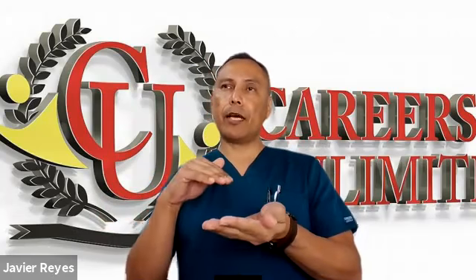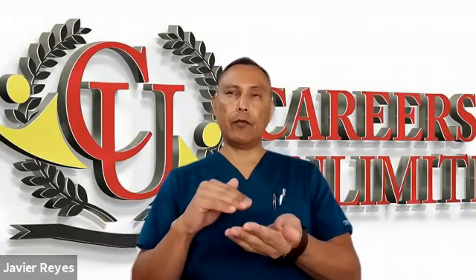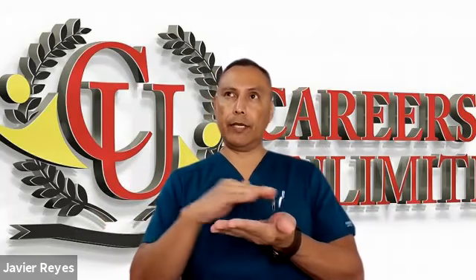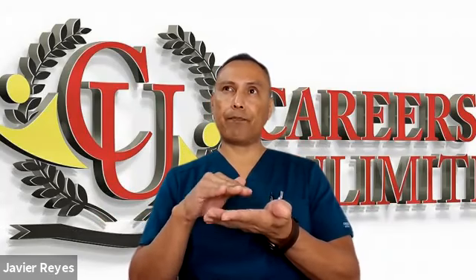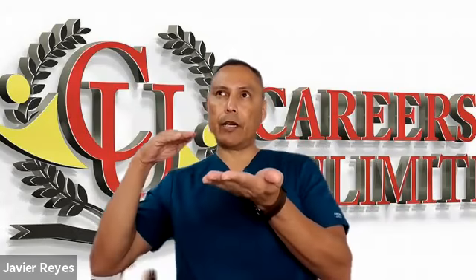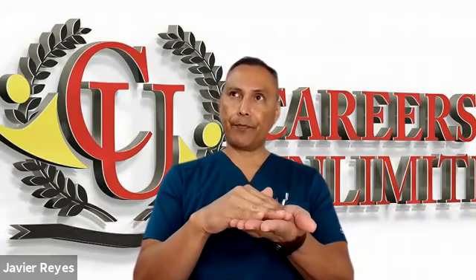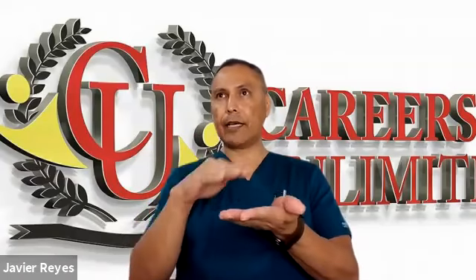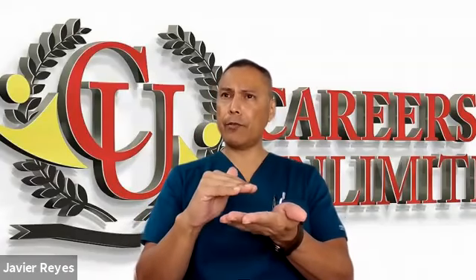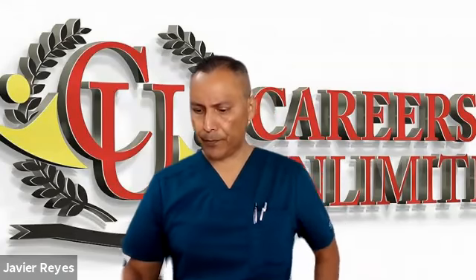So remember that the chest leads, or leads V1 through V6, view the heart in a horizontal plane, not in a vertical plane, but a horizontal plane. So they look at the electrical activity that's going across through the heart from the front to the back. So if there's any tissue that is damaged because of infarction in that area, in the septum or around there, the leads V1 through V6 should be the ones that are evaluated.